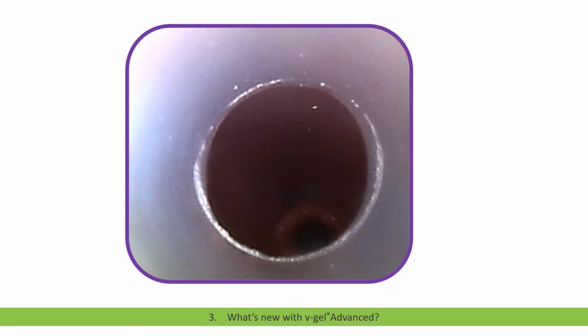Here you can see a video. This is taken with a bronchoscope through one of the V-gel advanced devices, and you can see the bronchoscope going into the pharyngeal section in a moment, and you'll be able to see that thin curtain wall seal wrapping around the larynx, and the arytenoid cartilages of the larynx sitting unaffected within the middle of the airway and the epiglottis untouched.